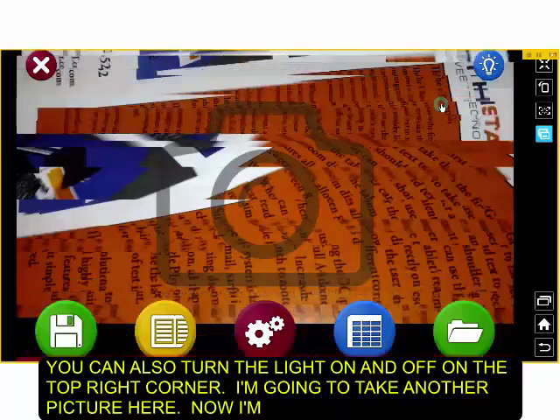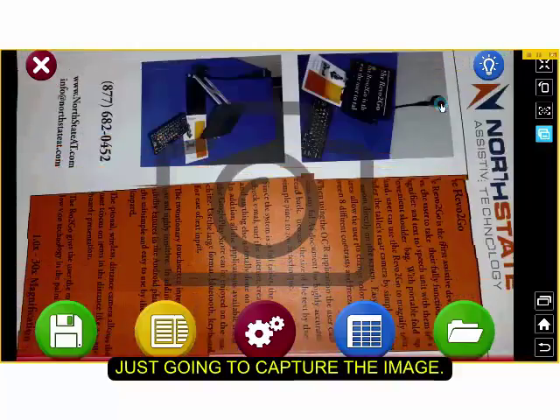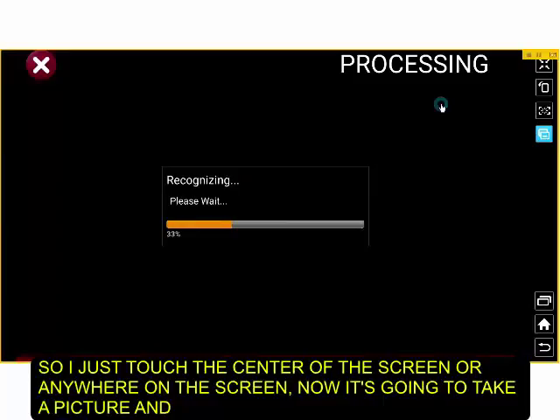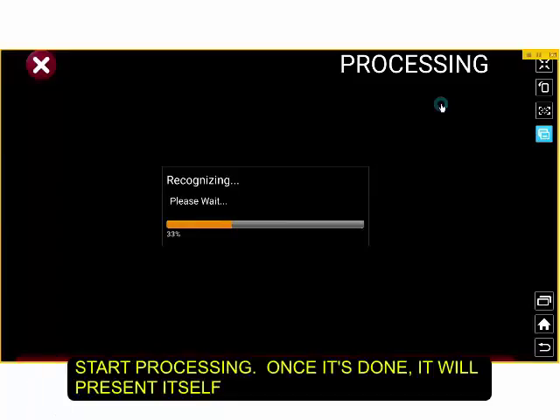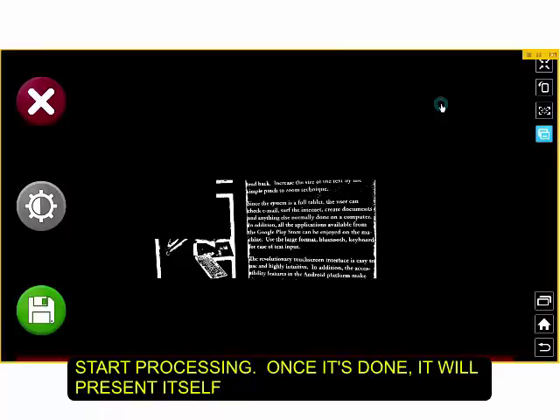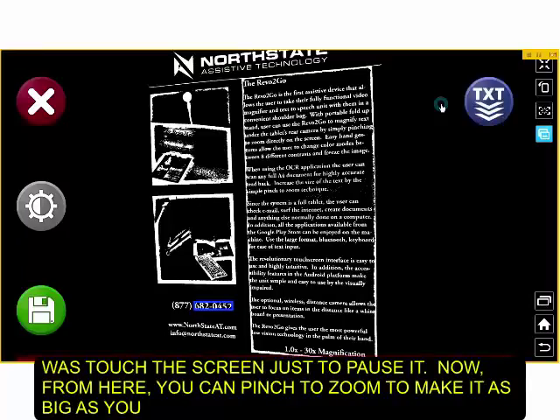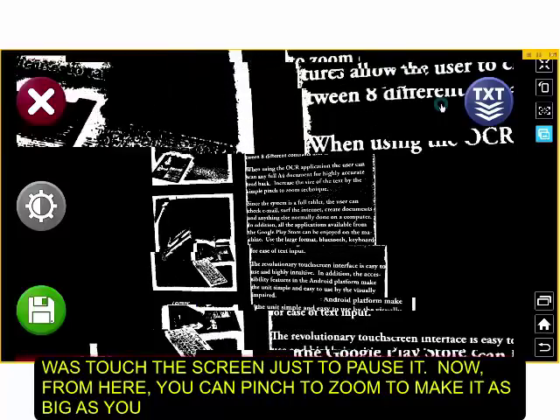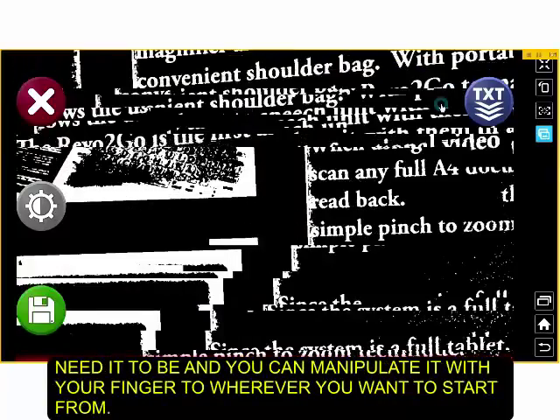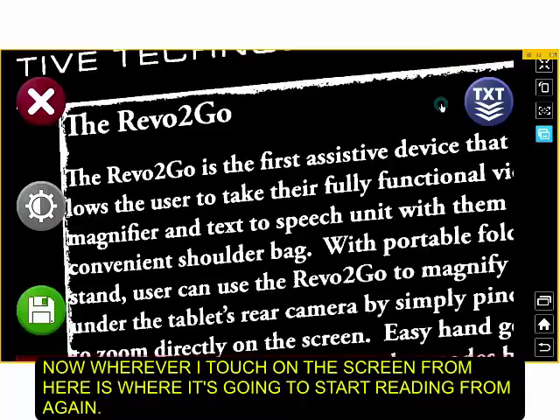I'm going to take another picture here. Now I'm just going to capture the image. So I just touched the center of the screen, or really anywhere on the screen, and now it's going to take a picture and start processing. Once it's done, it'll present it up on the screen. So what I did was I touched the screen just to pause it. Now from here, again, you can pinch to zoom to make it as big as you need it to be, and then you can manipulate it with your finger to wherever you want to start from. Now wherever I touch on the screen from here is where it's going to start reading from again.